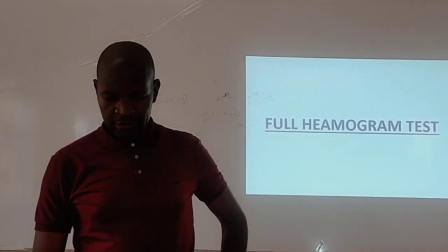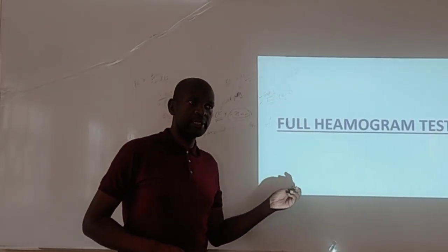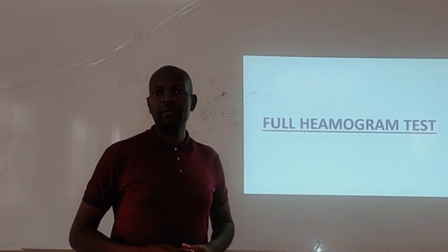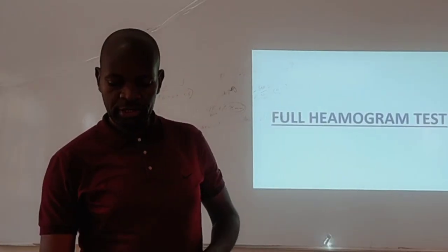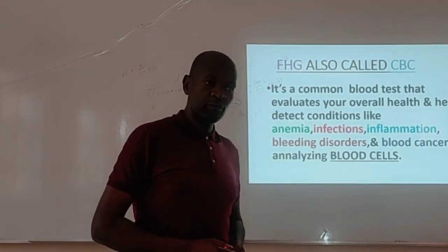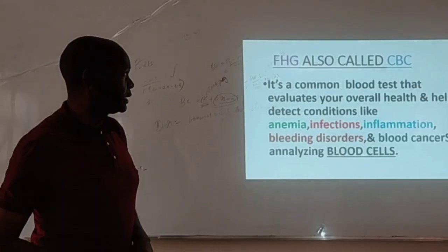Okay, hi everyone. I want us to look at a full hemogram test. This is a very common test that is done as a routine test, one of the basic tests that is done in our health facilities to most of the patients who visit the hospital setup. The full hemogram test is also known as the complete blood count.